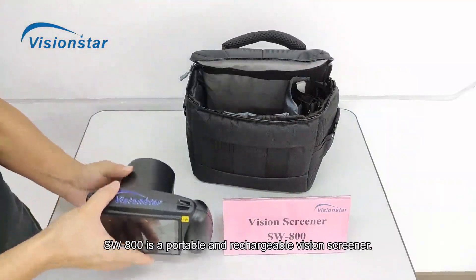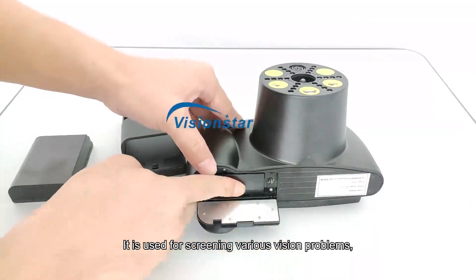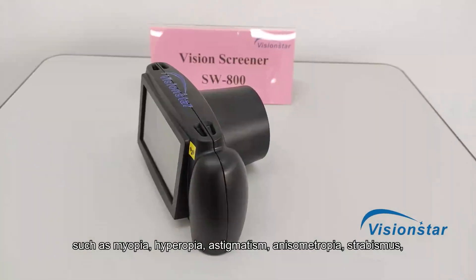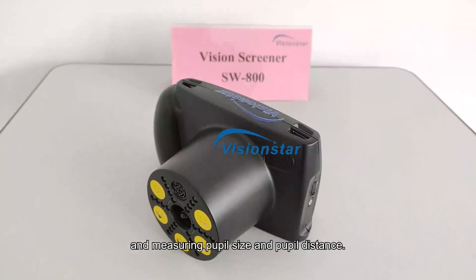SW800 is a portable and rechargeable vision screener. It is used for screening various vision problems, such as myopia, hyperopia, astigmatism, anisometropia, strabismus, and measuring pupil size and pupil distance.